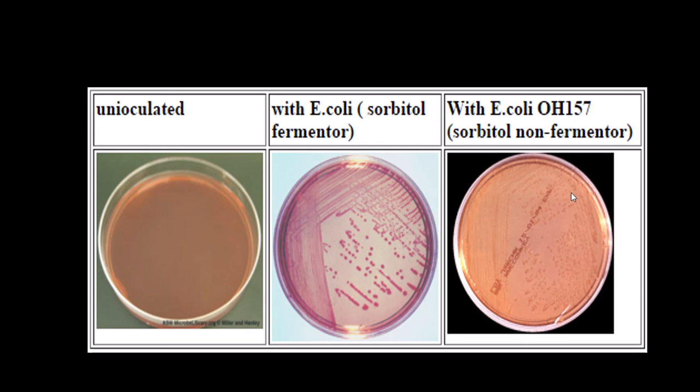So biochemically we can use it for identification. The H7 O157 strain does not ferment the sorbitol sugar. If the sorbitol sugar is fermented, it is not a pathogen. This is really very, very important to know.